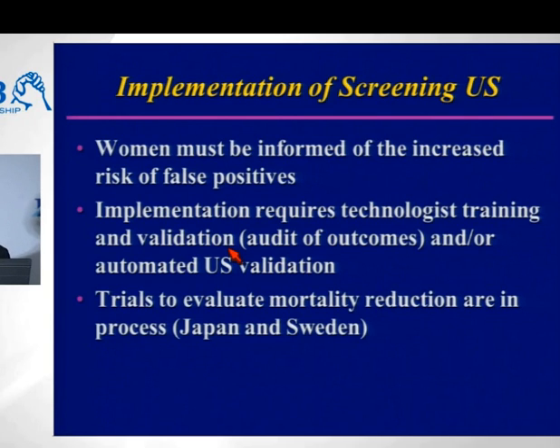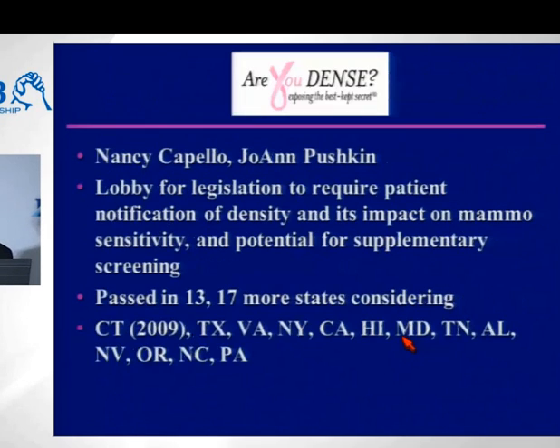We actually have our technologists do the screening ultrasounds now, but you really need to train your tech well so you have complete comfort in them doing the examination. Otherwise, physician-performed breast ultrasound is completely reasonable. It just takes time. And there are trials ongoing right now to evaluate mortality reduction.